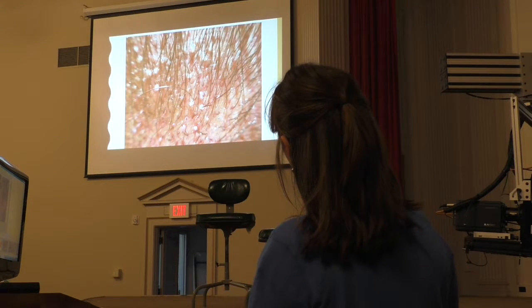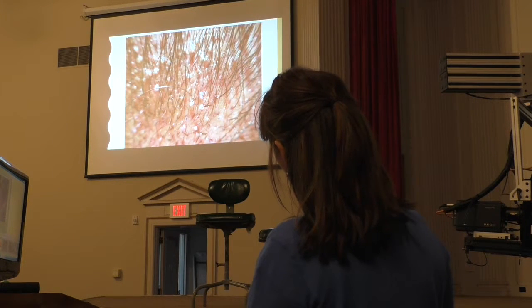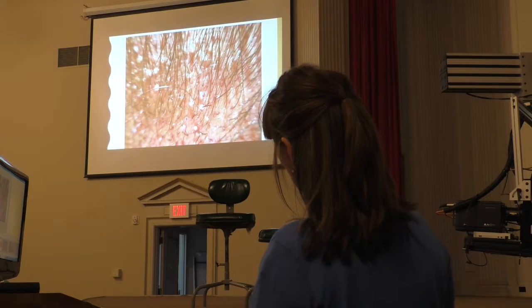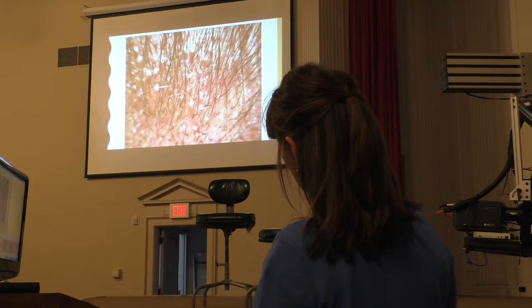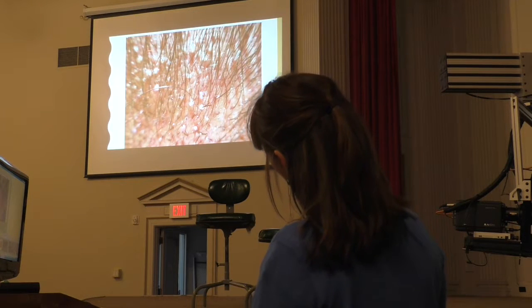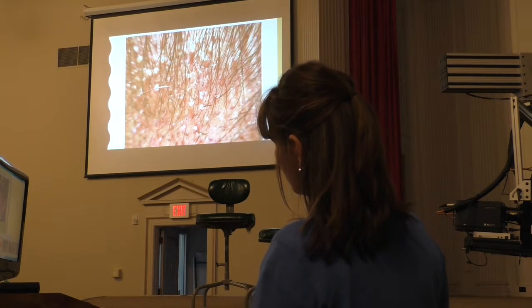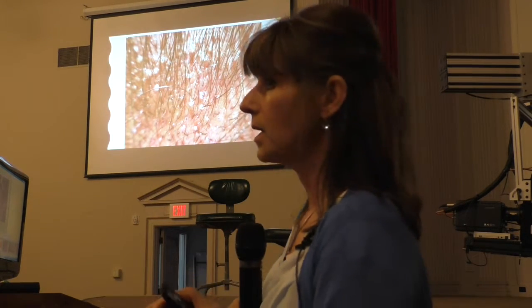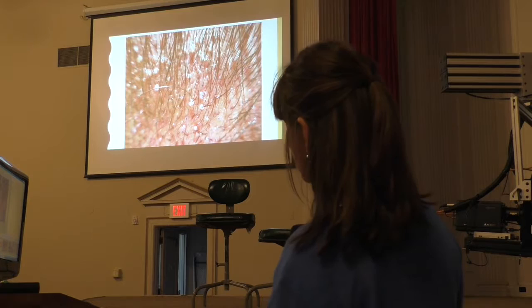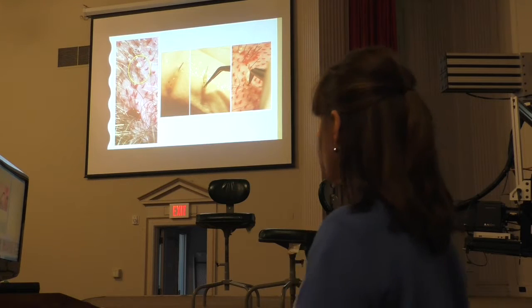Some of these grafts, what I want you to see, for example, is this is a little bit deep. This is an empty site. You have to train your eye to see things. You see epidermal cap, epidermal cap, epidermal cap, empty site, empty site, empty site, empty site, empty site, empty site, dermal cap. So when I glance at this, I'm thinking, maybe it's an angle, maybe it's a matter of me coming from the side. I need to look at it better. Maybe they didn't place any grafts, maybe they're sinking, they're too deep. Train your eye to look for things.